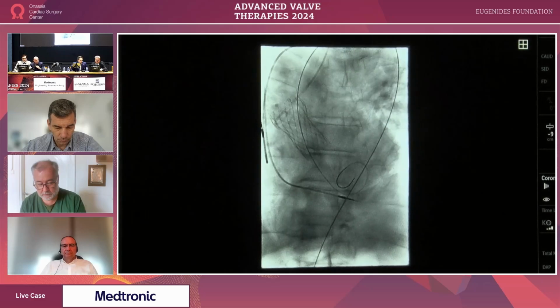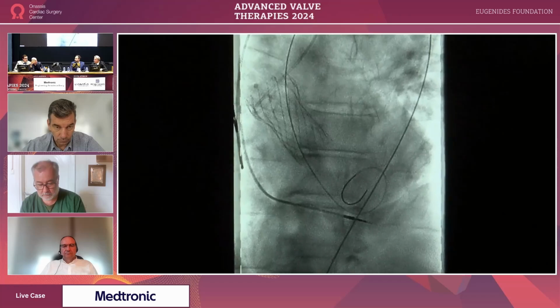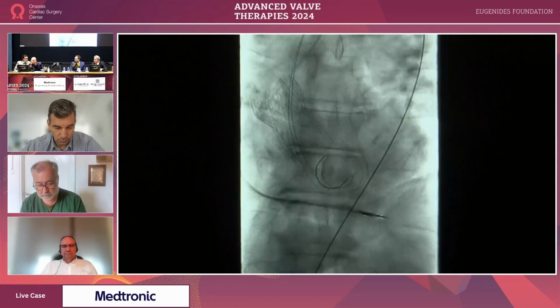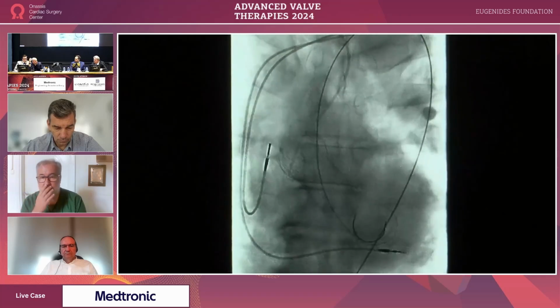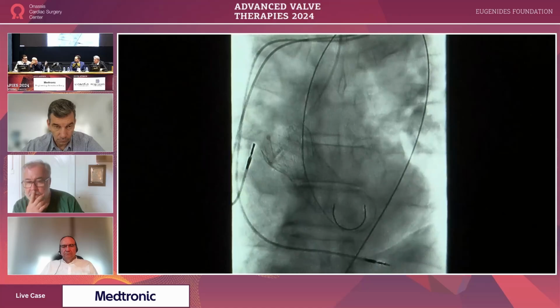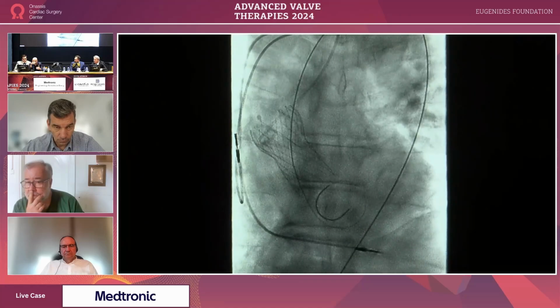By the way, in the meanwhile, I truly don't understand why, maybe I'm wrong, by the end of the procedure, I'm going over this wire with the pigtail, I'm taking out the wire, I'm measuring pressure. If it's good, I'm going with the pigtail out and I'm injecting without this heavy-duty wire that sometimes creates AI by itself. And again, I see people who are injecting with the wire inside.